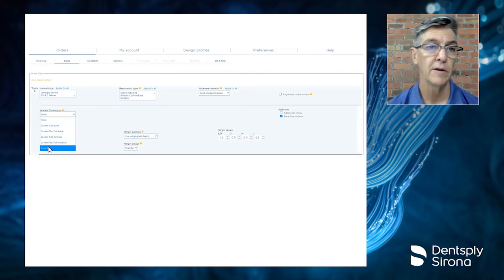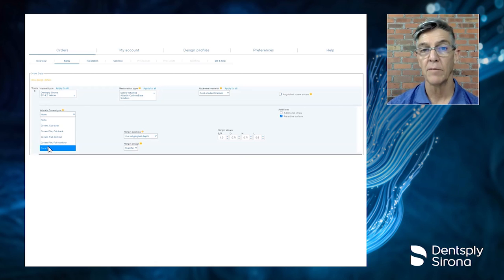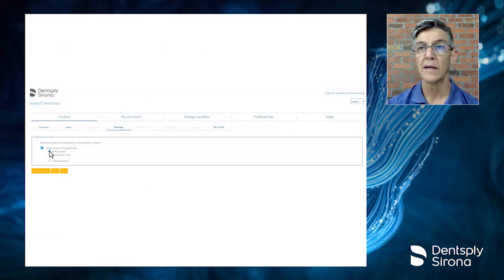Now they have an option here. They could have Atlantis make the crown. They could have Atlantis make a crown with a cutback, or they could choose a core file. And what a core file gives your laboratory is the opportunity to work on the finished restoration before actually receiving the abutment, because the core file is the design of the abutment. So once that's done, they have an option of choosing angulated screw access, and they can choose it specifically for which implant they want to work with. So in this case, on the central incisor, we're asking them to choose that, and that's what they're going to do. Once this is done, they can decide if they want to order the printed models.